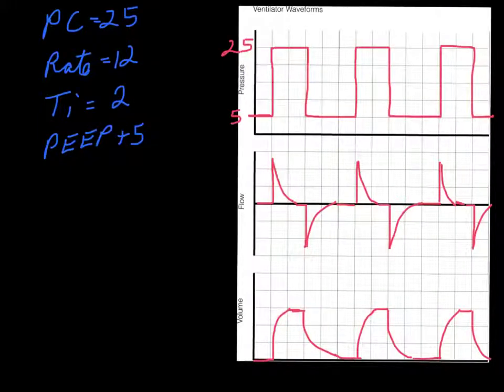Now in this slide, I'm going to show you our regular pressure over time graph that we saw in the previous slide. Here are our ventilator settings. They haven't changed. But I also wanted to introduce the concept of flow. Here we have time triggered, and so we have the inspiratory flow, and it builds up quickly and then declines slowly until we have an inspiratory pause, and that's a critical element where there is no flow. Then we have exhalation occurring. So every 5 seconds, we're going to have inspiration, a short inspiratory pause during that inspiration, then exhalation occurring.